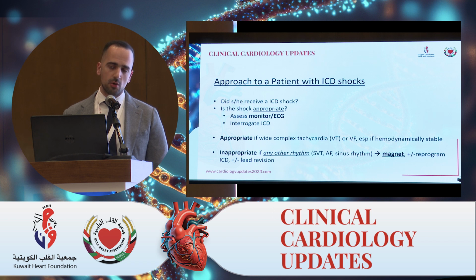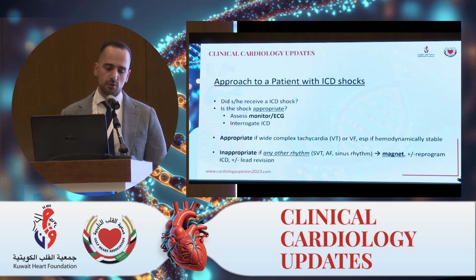In that situation, the only way to determine whether the shock was appropriate or not is to get a programmer, interrogate the device, and review the electrograms. It's appropriate if it was for VT or VFib. But like I said, any other rhythm is considered an inappropriate shock. And the way to manage this is to reprogram the device, plus or minus revise the lead.